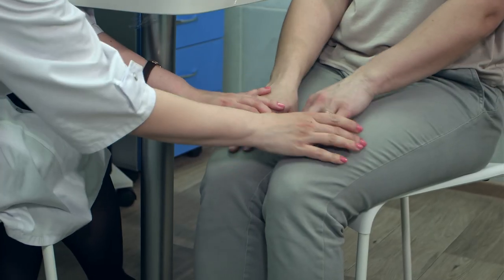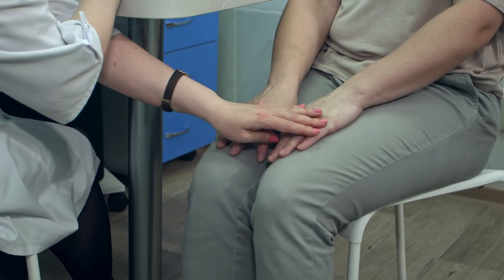And therefore, if there is a problem such as pain or weakness in one part of the body, then we can check the reflexes in the nerves that run to those areas to see if we can locate where the problem might be.